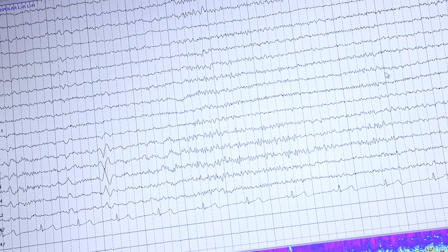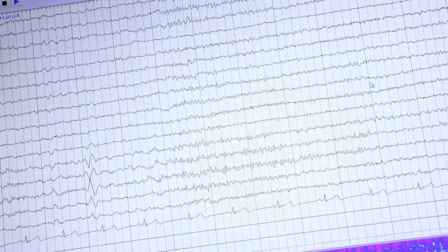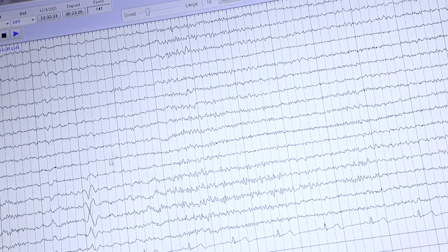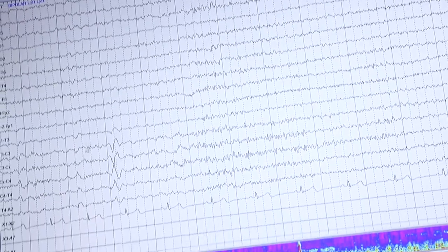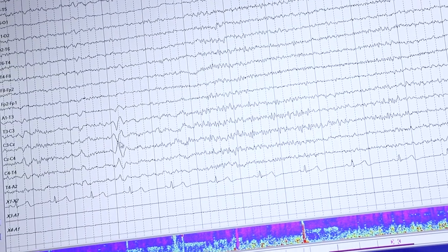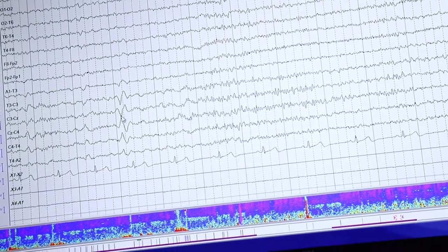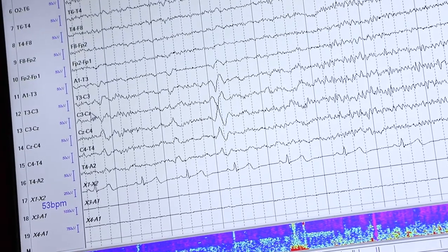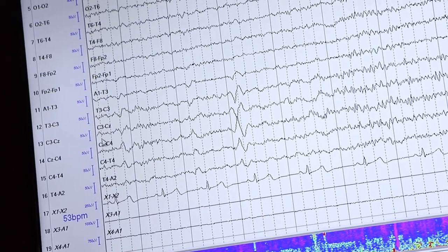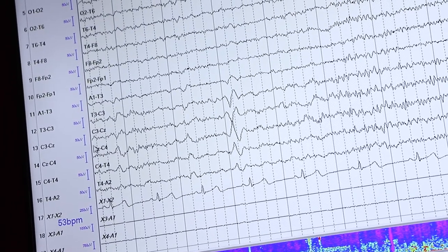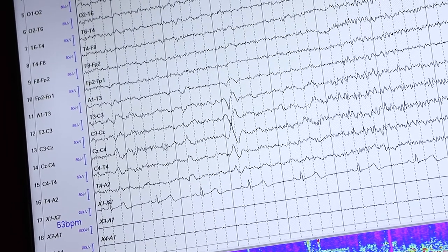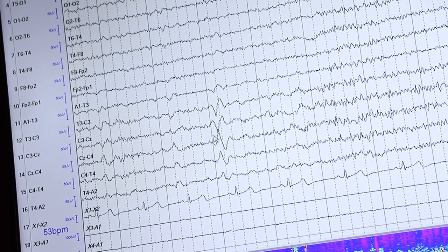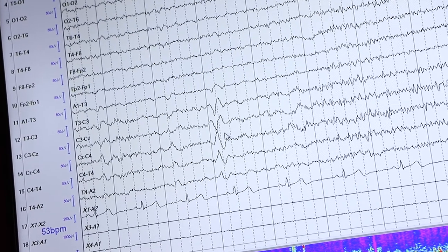Then you have Stage 2. Now what happens in Stage 1, in addition to alpha dropping out, there are these markers called vertex waves. They happen right at the center of the brain on this electrode called CZ, right in the middle of your head on your scalp.